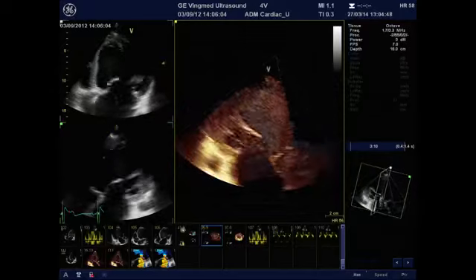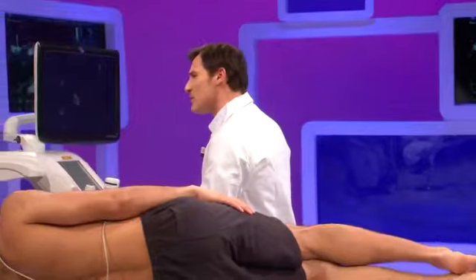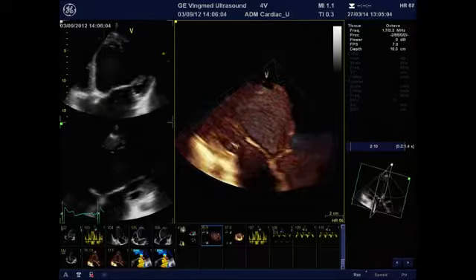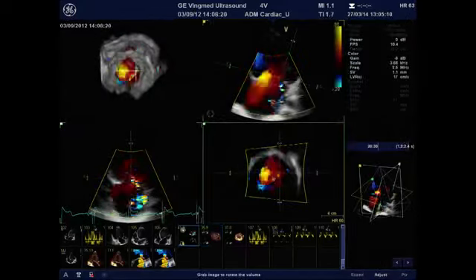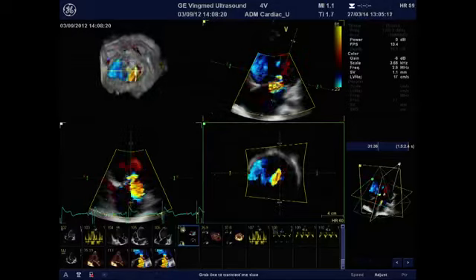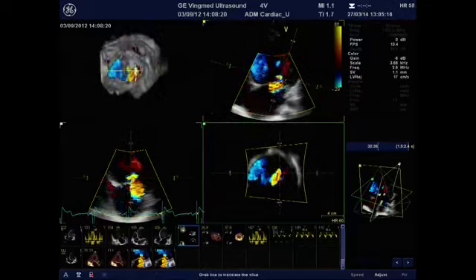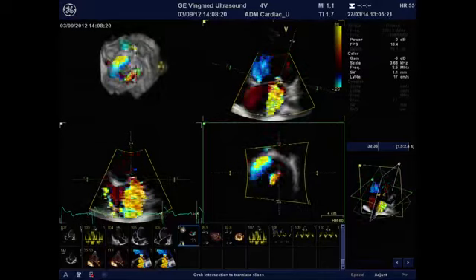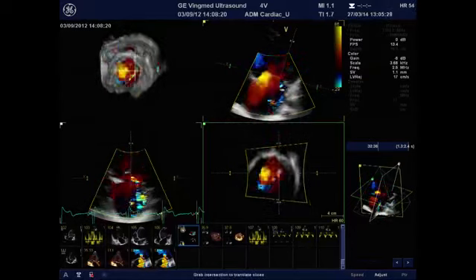Now, maybe to illustrate a bit what I said regarding the regurgitant flow across the regurgitant orifice and the geometry of the regurgitant orifice, let me take a 3D image with color flow Doppler. And here you have different views, for sure sections, and you can crop here just to be sure that you are in line at the level of the regurgitant orifice. And if we are exactly located at the level of the regurgitant orifice, there is something very strange here.